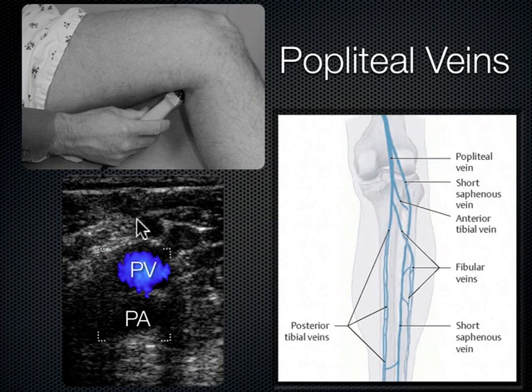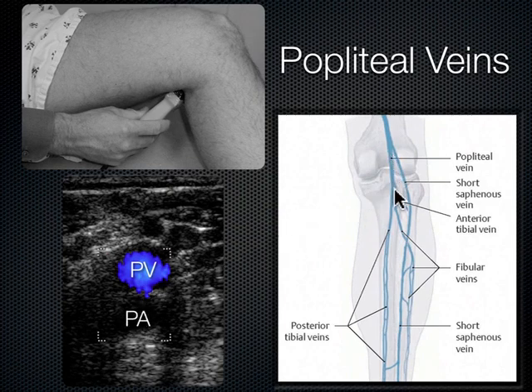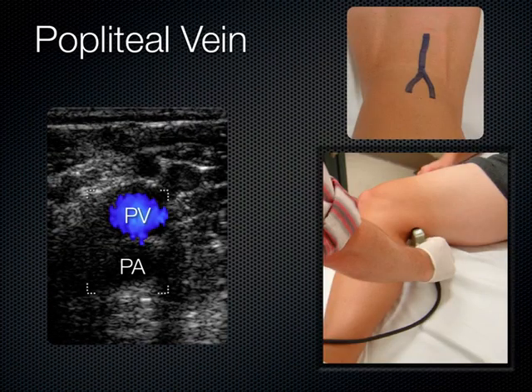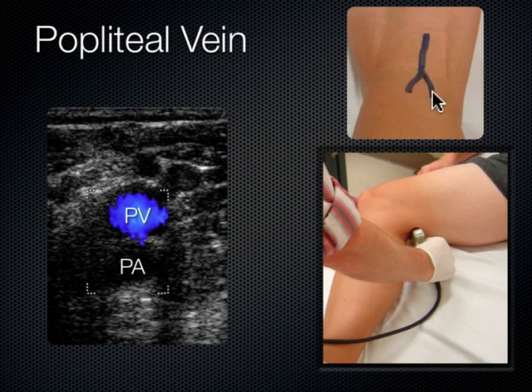The first anechoic structure we see in a transverse plane is going to be our popliteal vein. The deeper structure — closer to the bone — will be the popliteal artery. Eventually that popliteal vein will bifurcate and trifurcate. You're looking from the superior aspect of the popliteal fossa down until you see it bifurcate right at the top of the calf, in that roughly five-centimeter area you're trying to compress.